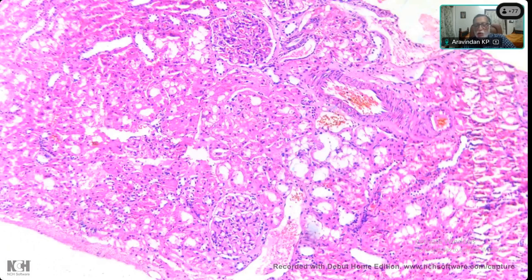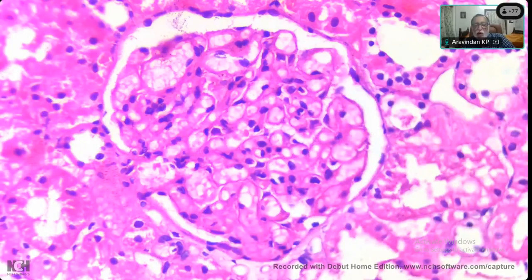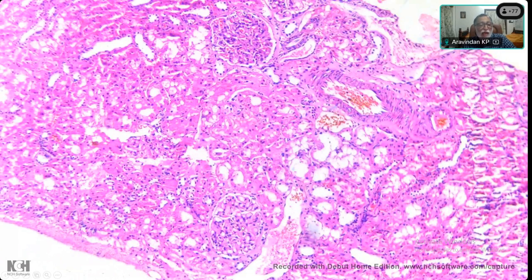You want to go one higher to? Yes, sir. We can't see any pretty much. So we'll pick one of those. In other words, see, are all these glomeruli looking alike or are they looking different?